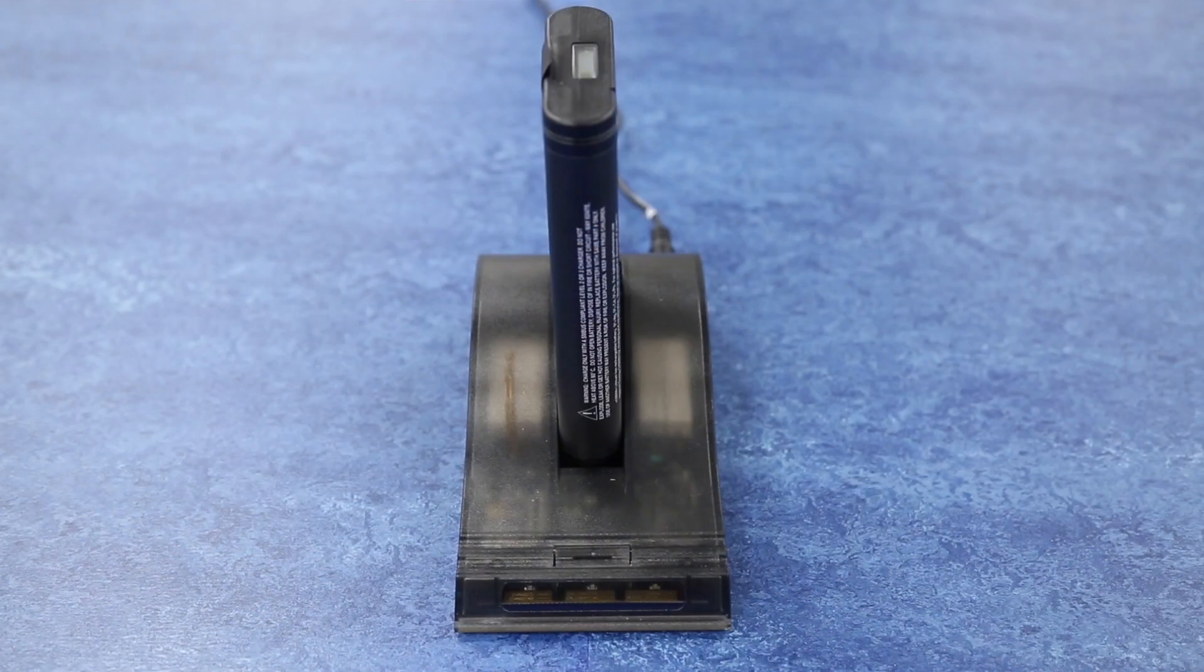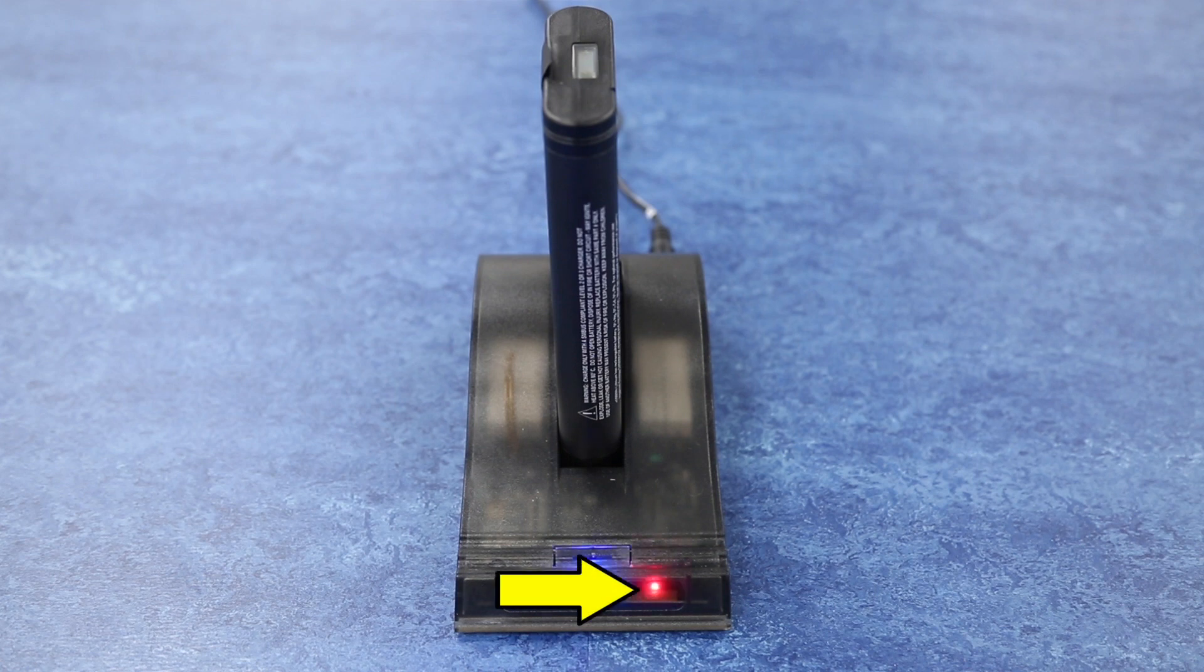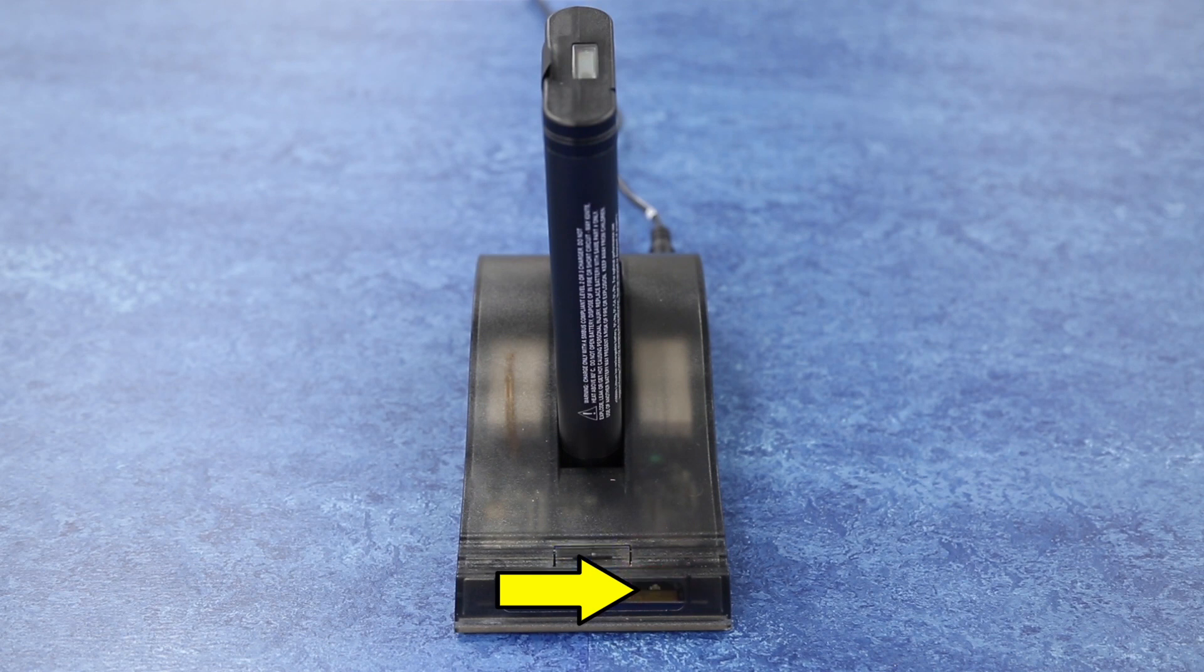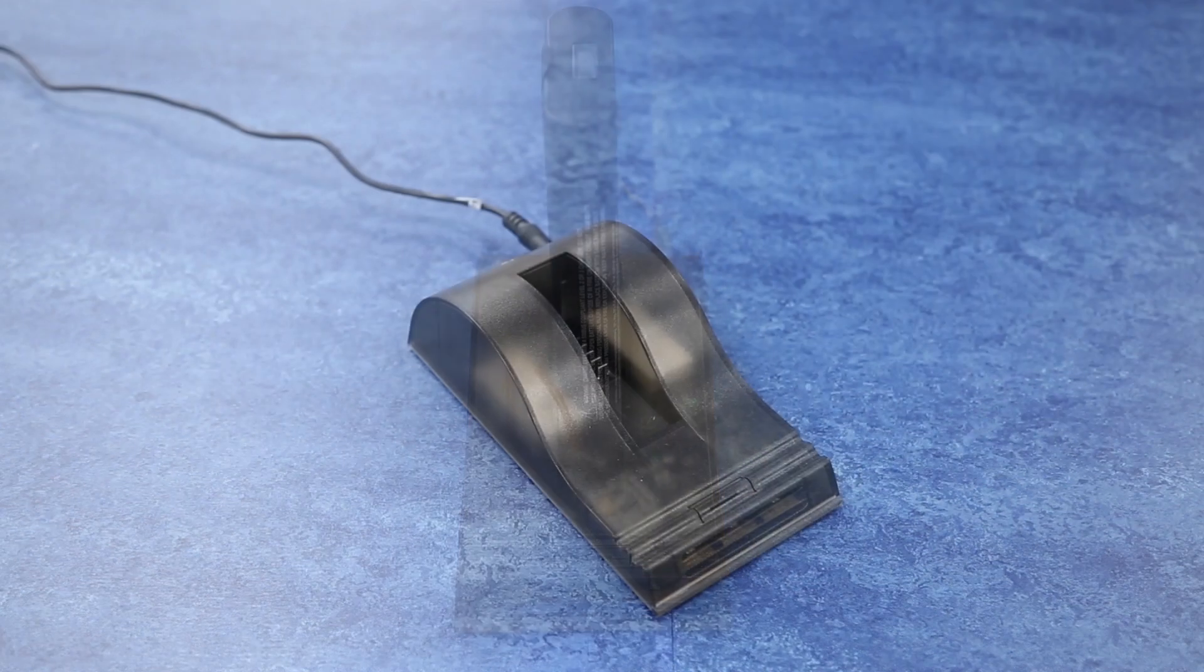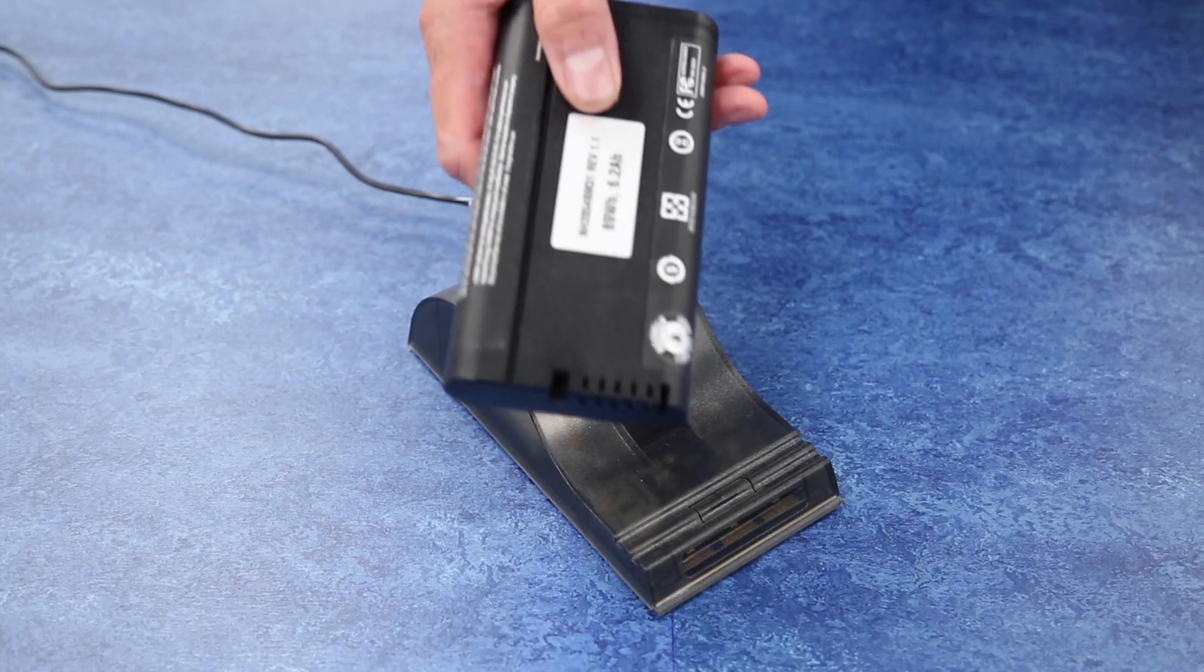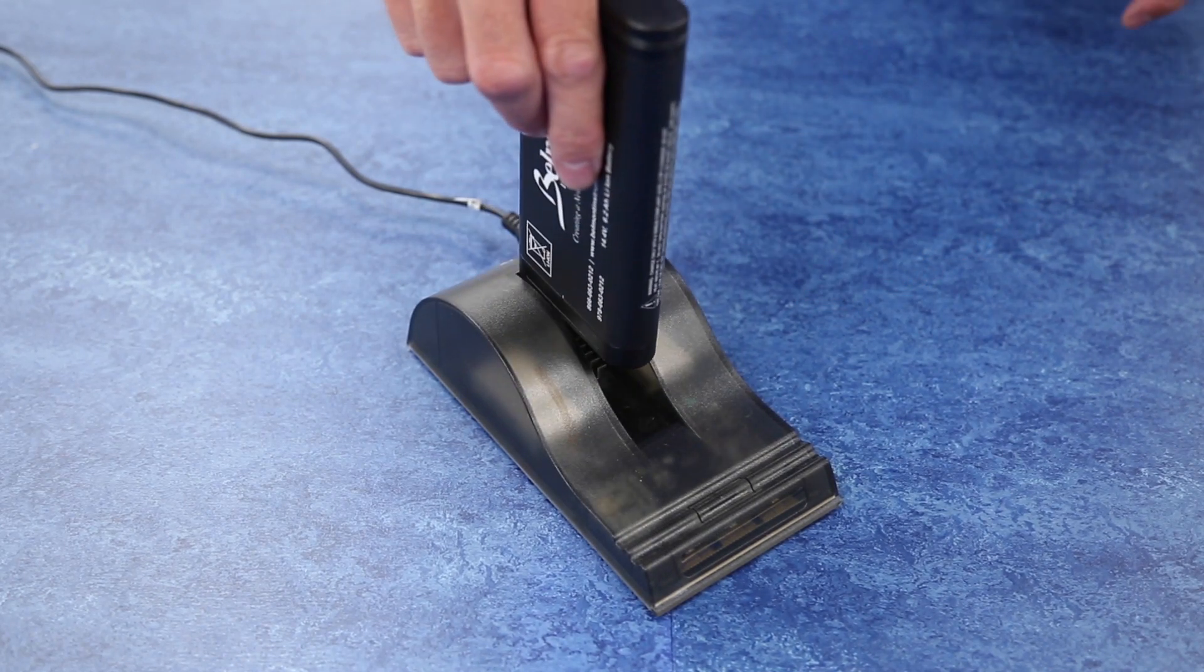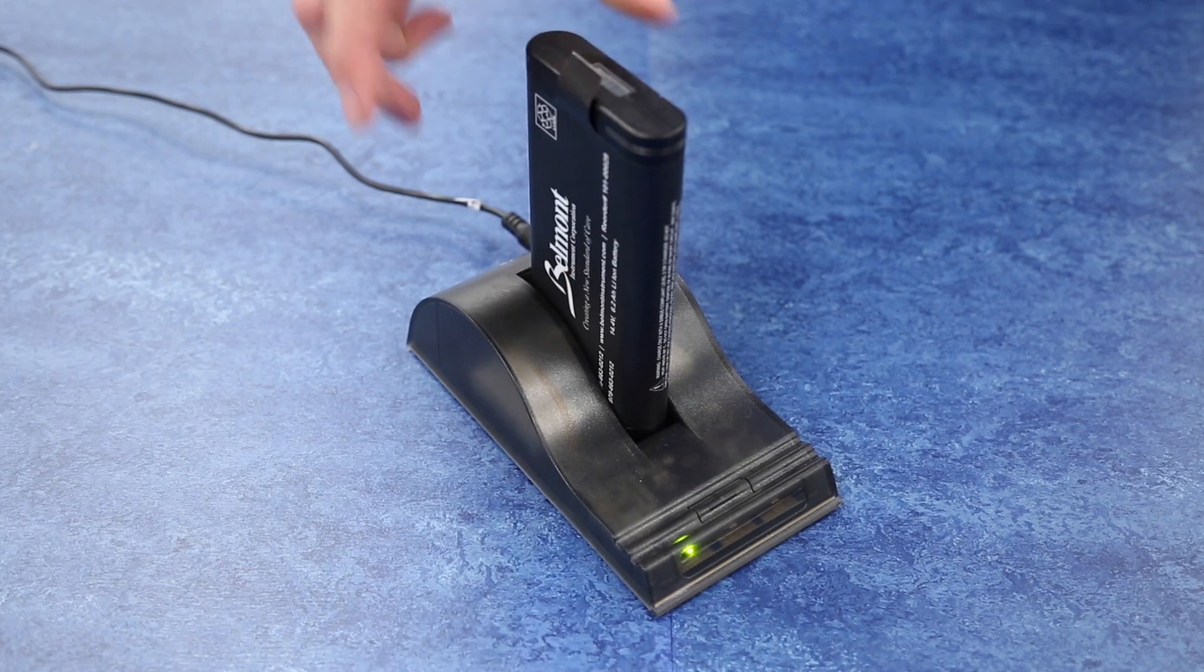When the battery fuel gauge needs to be recalibrated, the red LED indicator on the battery charger will flash. The recalibration is used to ensure the reliability of the battery capacity. To recalibrate the battery, first place the battery into the charger bay, ensuring that the 5-pin connector is fully seated.